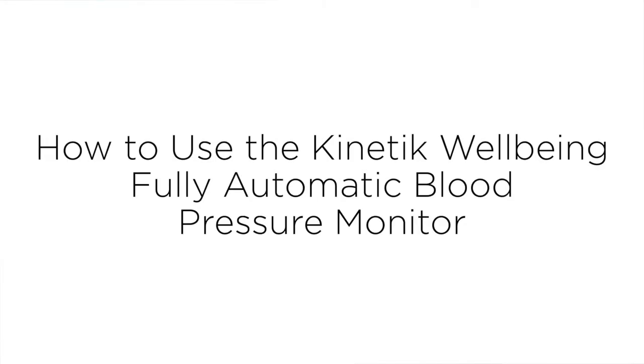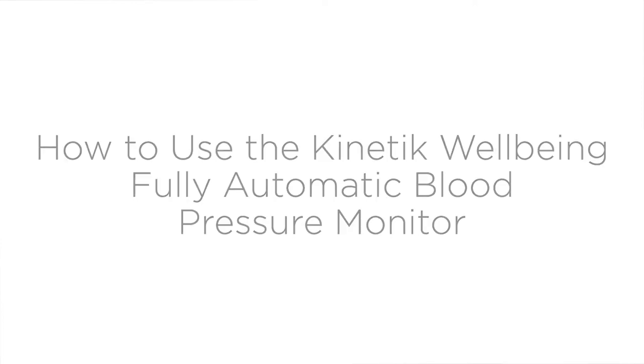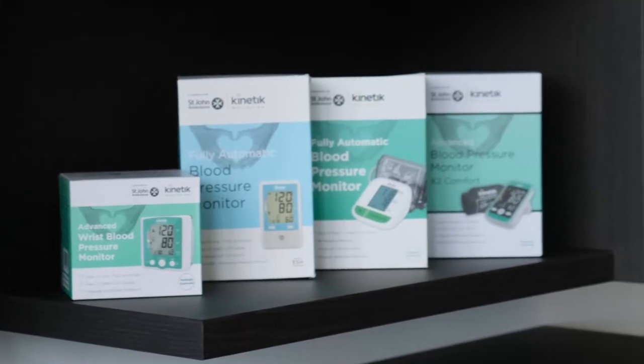Kinetic Wellbeing have developed a range of accurate, simple to use and affordable blood pressure monitors. Here we will show you how to use our VIHS approved WBP1.